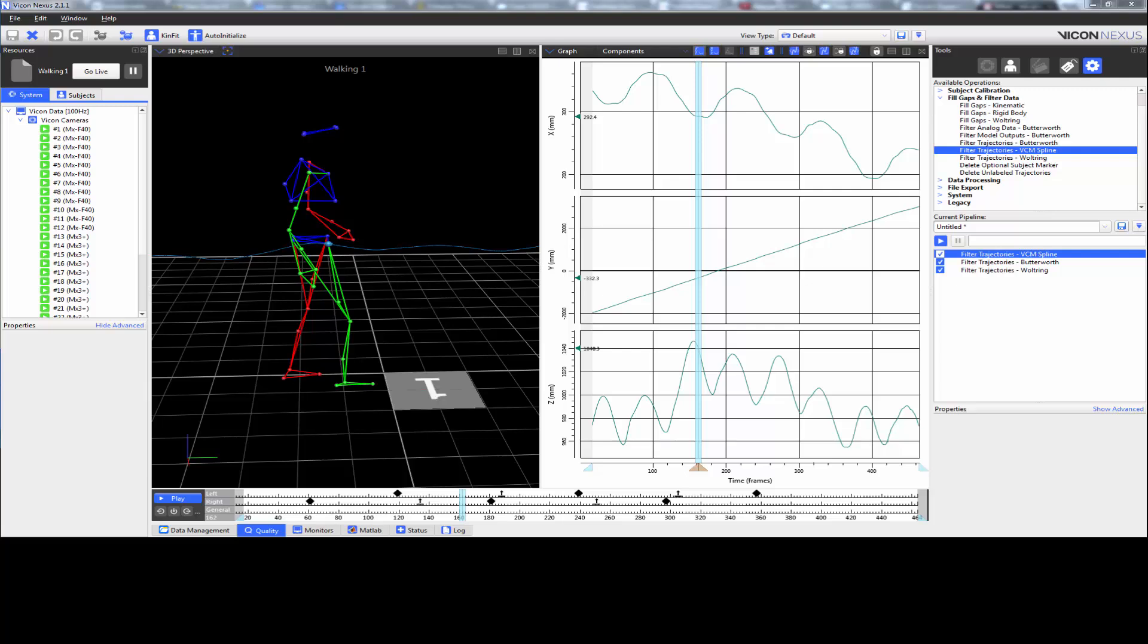Next is to provide several options on how to filter trajectory data. These options are the VCM filter, the Butterworth filter, and the Woltring filter.